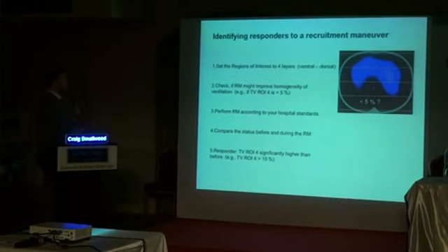So there are a few different ways you can do this. This is one that I think we have most experience with, and there are subsequent publications that I think validate our methodology. But identifying responders to recruitment maneuver. Recruitment maneuver is something that you should approach with great trepidation. Although it's indicated in select subjects to improve mechanics for long-term benefits in terms of reducing ventilator lung injury and reducing length of ventilation. If you do it in patients who don't need it, you've just exposed them to a risk and increased pressure and volume that they are probably going to be potentially harmed from.